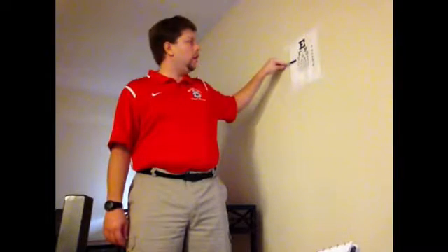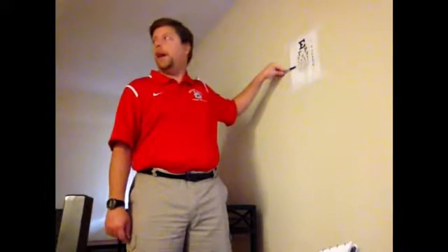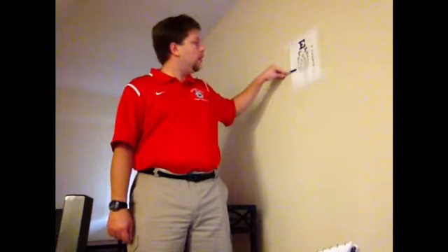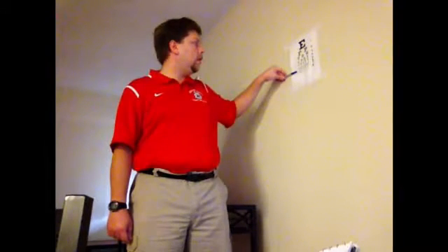All right, so go ahead and cover your left eye for me. Can you read line 1? E. Line 2. FP. Line 3. TOZ. 4. LP ED. Okay. Line 5. PE CFD. Okay. And line 6. EDF CZP. Okay, and then line 7. FEL D.